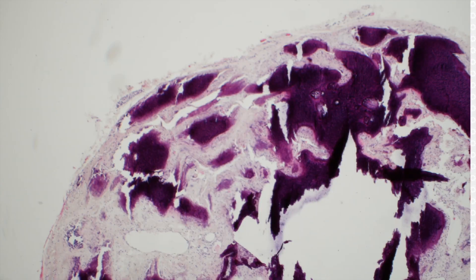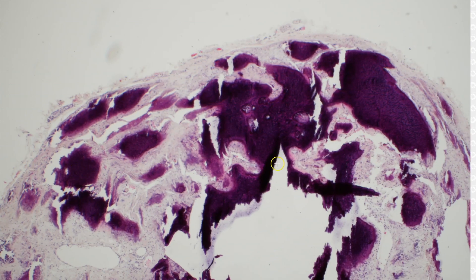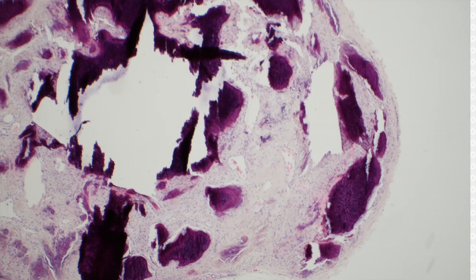They can have extensive calcification, and this one is probably actually forming into real bone — it's just hard to see here because it's not decalcified at all.